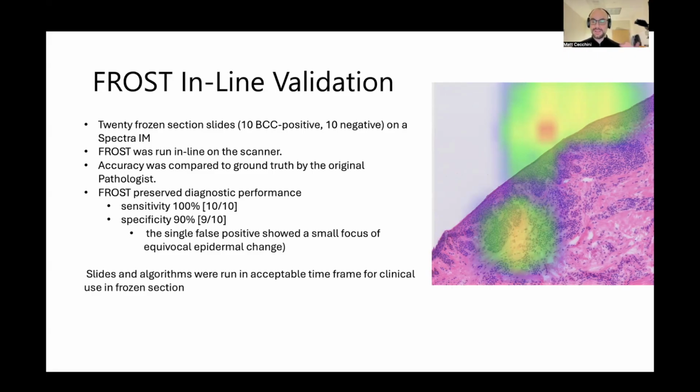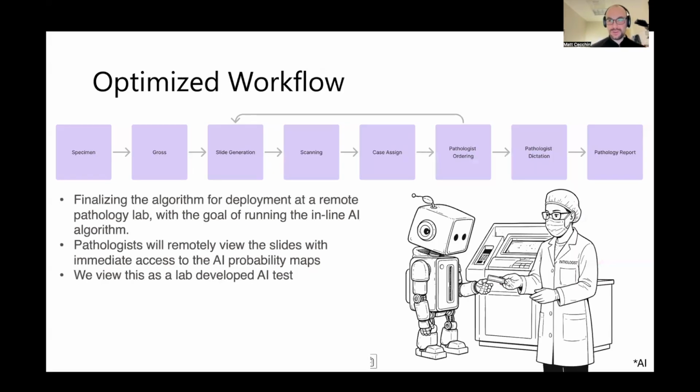And so this is what I'm getting at with this idea of pathologist-driven AI tools. I think this is how we have to think about this. This is not a tool that works for every lab. This is a tool that works for my lab, with my IHC level and on this one specific scanner, right? And it wasn't a monumental effort to get this validated and used. So I would challenge us to think through these things and then start using them, right? We should be building these, validating them, and getting them going.